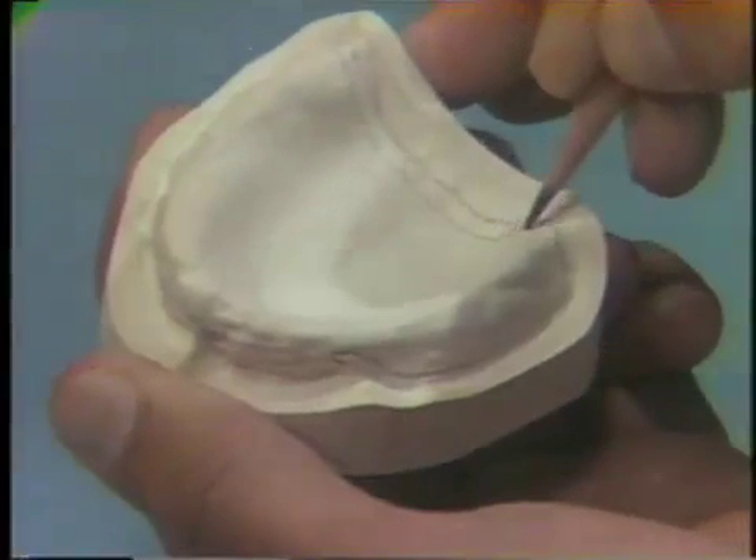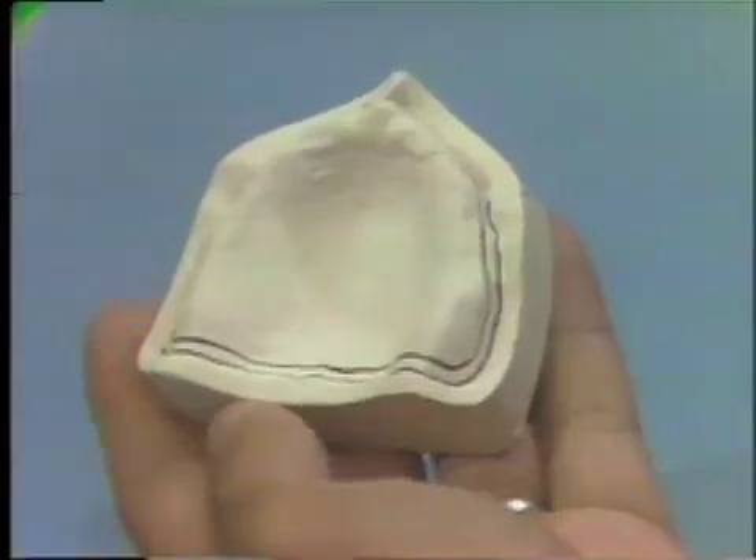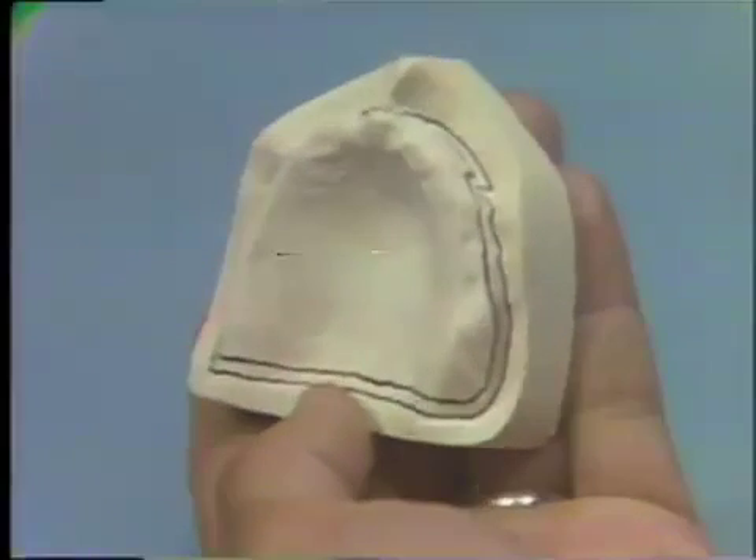Note the relationship of these lines to the fovea palatine. For a better view, we have used a felt pen to darken the outlines.